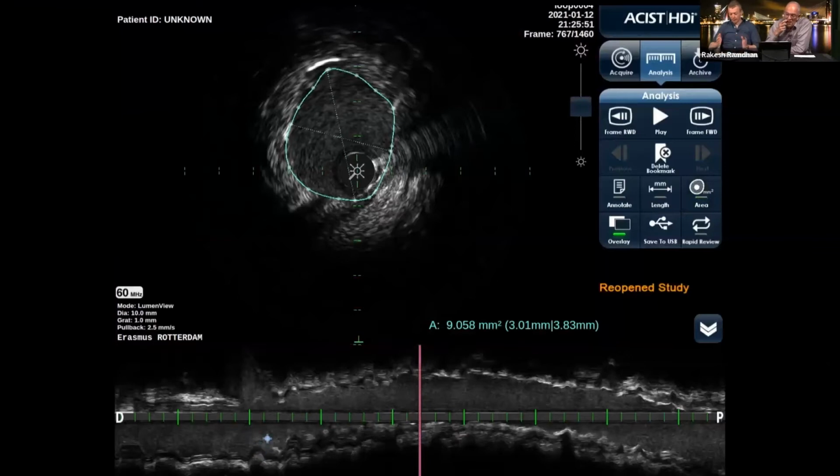So in brief, remember those optimal stenting criteria: a plaque burden at the edge of less than 50%. Jurgen nicely alluded to that already in the sizing part of the pullback. The second thing is to have optimal stent expansion. That's perhaps also the most important one, which can be identified as being either a minimal stent area larger than 5 or a minimal stent area which is at least 90% of the distal reference segment.